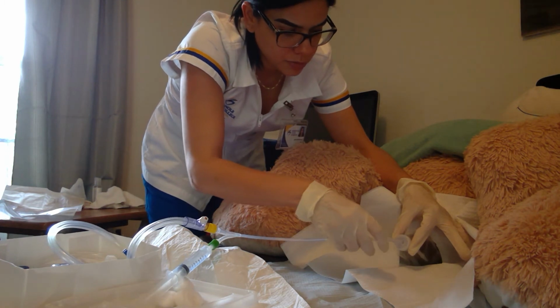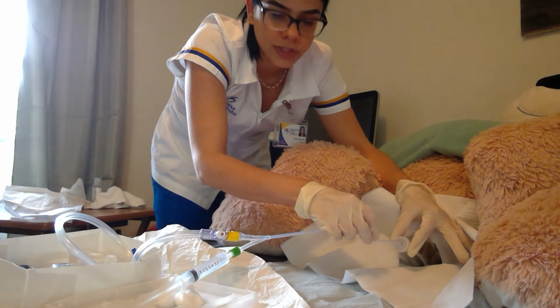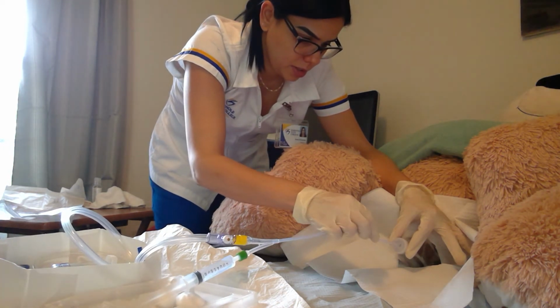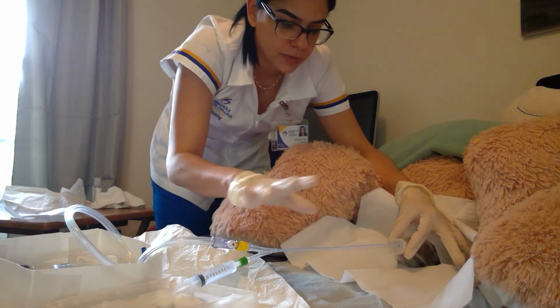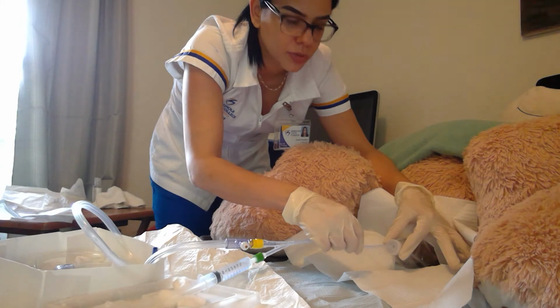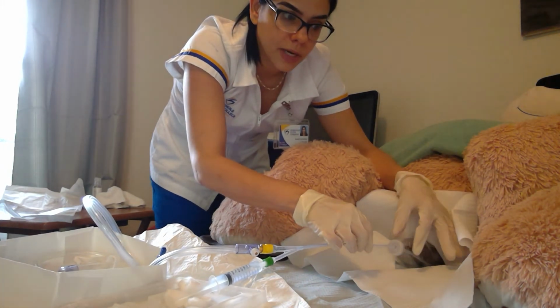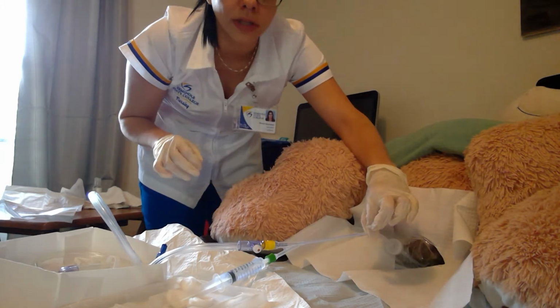And I'll go 2 to 3 inches down or until I see urine. Okay. Let's say I see urine now coming down. So I'm going to go ahead, I'm going to go 1 to 2 inches more. Once I do that, I can release my contaminated hand and I can just hold it there.